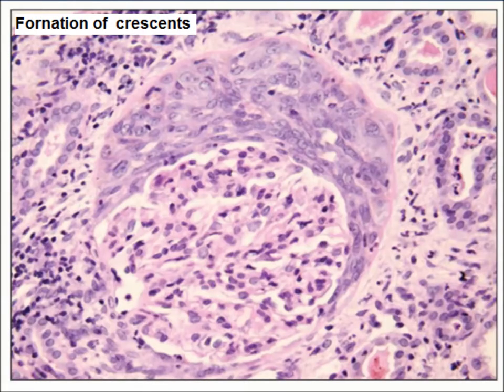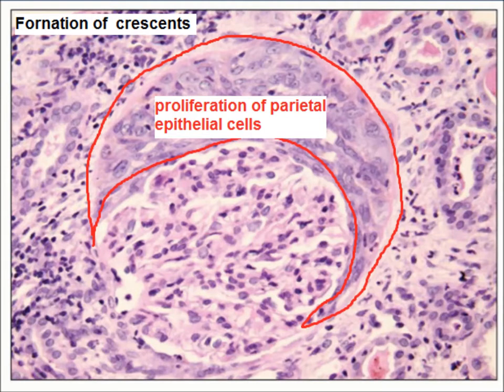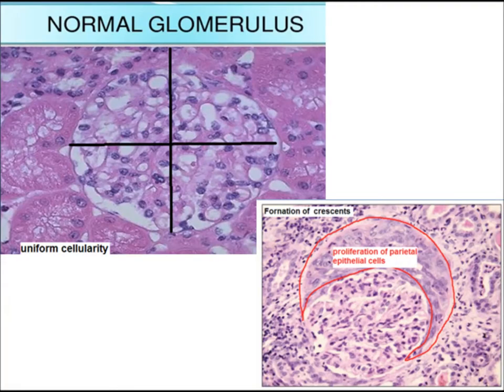You can compare the normal glomerulus with the hypercellular glomerulus. In this photomicrograph, you can appreciate a crescent, which is due to the proliferation of parietal epithelial cells. A crescent has a half-moon shape, and it results from proliferation of parietal epithelial cells. This is also a hypercellular glomerulus. You can compare in this slide with the normal glomerulus.